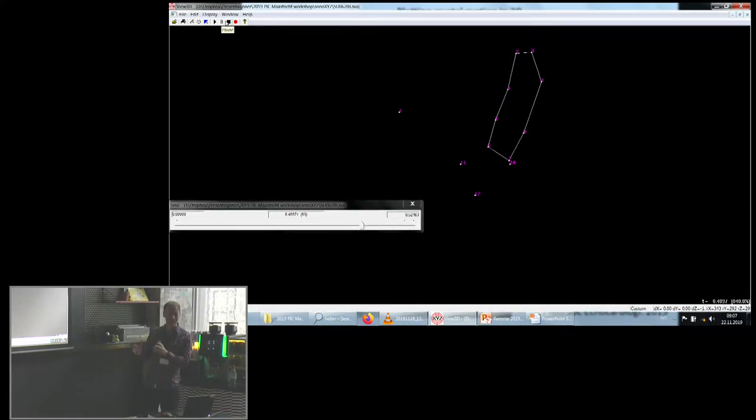And this is the program that shows after this analysis. These are the apical crystals. These are the 3 crystals on this ring that's fixed. And these are the crystals around the mitral ring. I drew some white lines between them just for illustration here, and you can kind of see how this moves in 3D space. So this is a lot of fun. I always thought that the valve ring was going to be really... Yeah, that's not true, is it? This is exactly what this project was about, to see how this valve ring deformed during different loading conditions and so on.